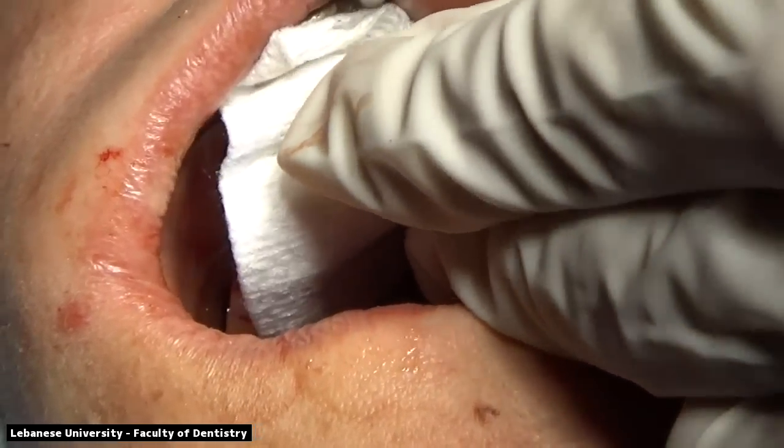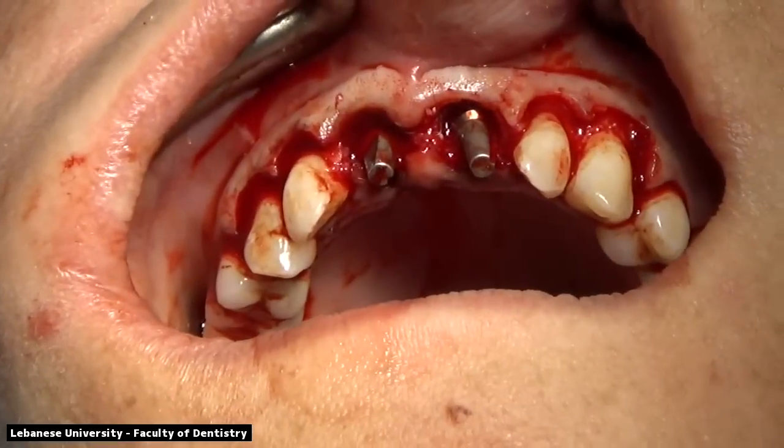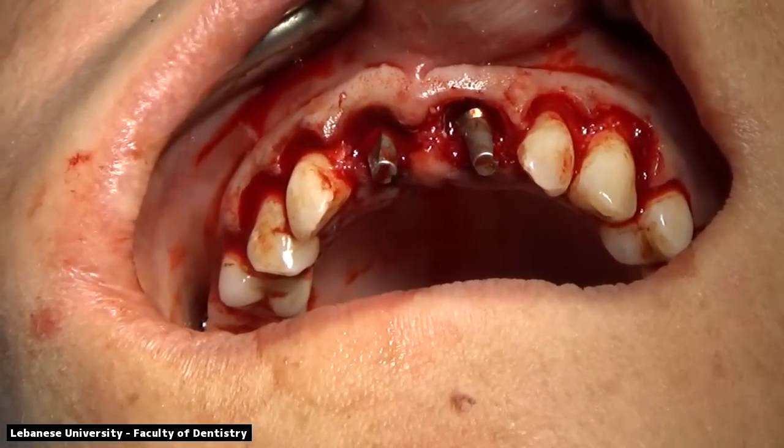As you see in this case, we're closing the site with a gauze so that we do not get any shards of the acrylic material.